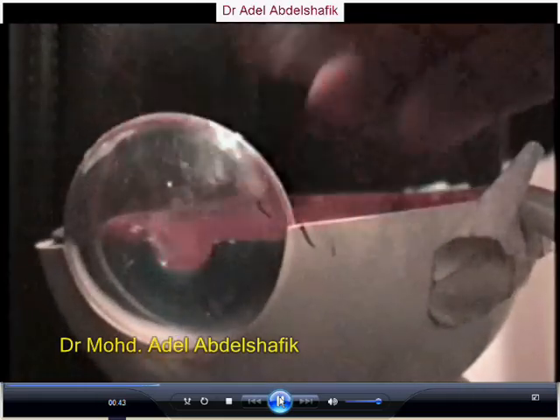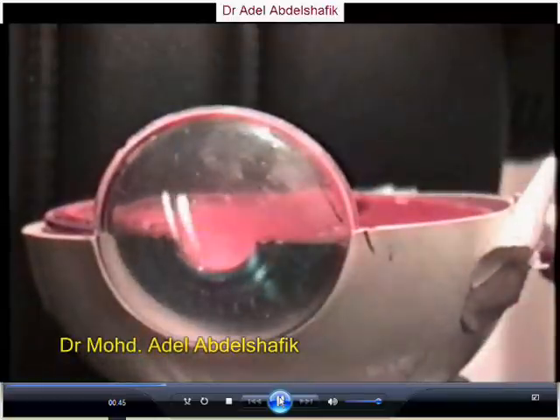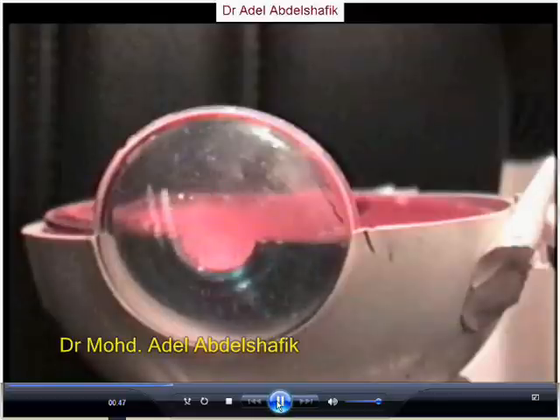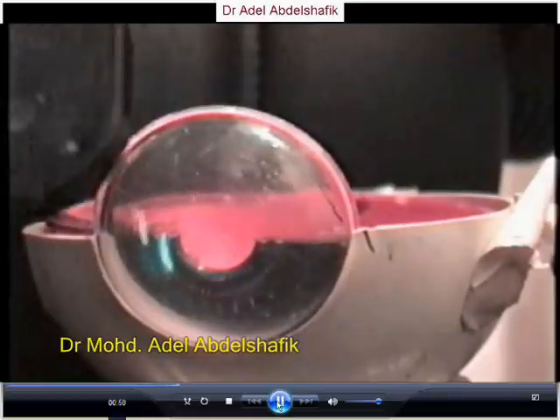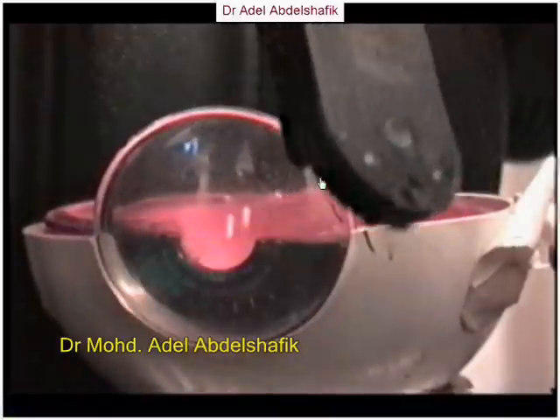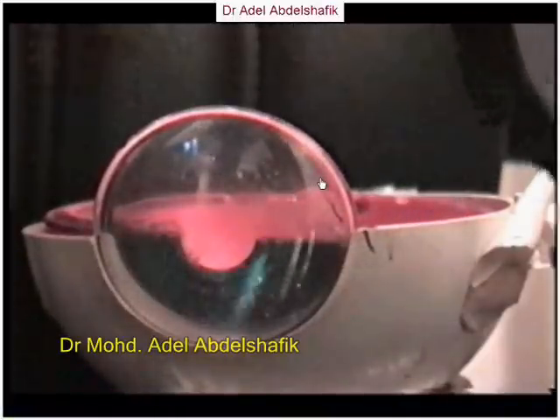Now I'm taking the lens out. As you can see here, light reaches the iris. So this distance is the anterior chamber. This is the source of my illumination. You can make a section in any part you want in the cornea.